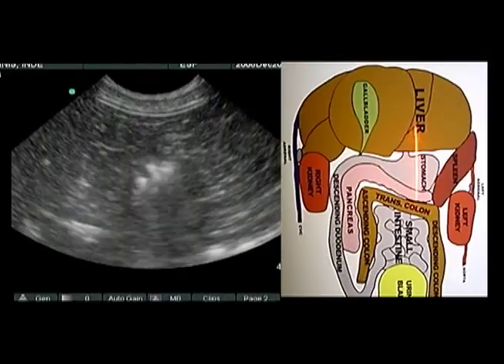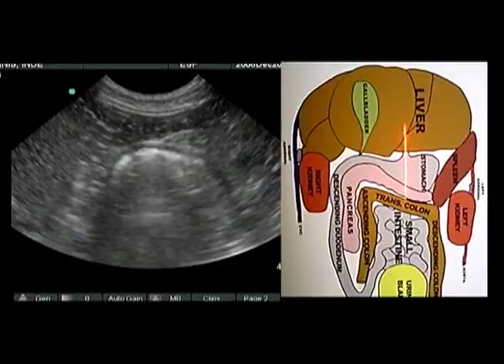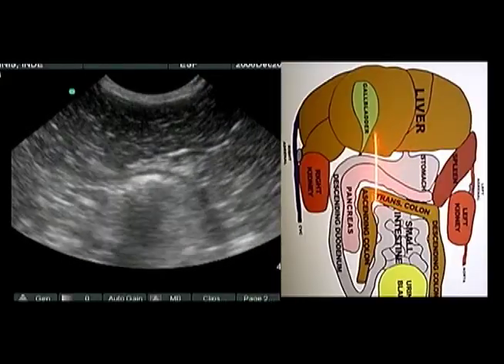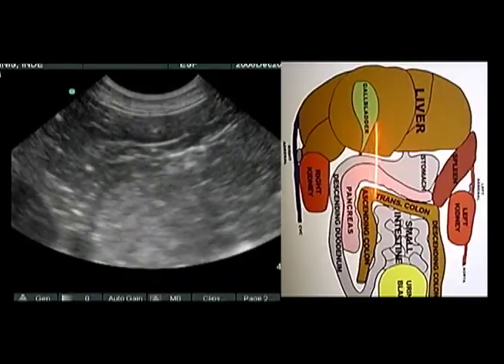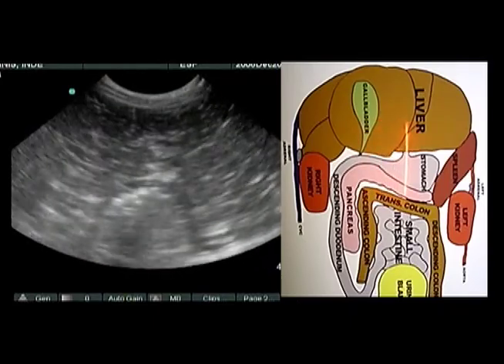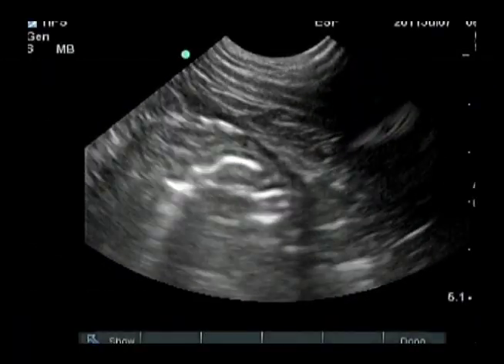The only thing you see on the ultrasound screen is what lies inside of the ultrasound beam. In this case, part of the stomach. To see more of the stomach, you must use the transducer to move the ultrasound beam. Your movements of the ultrasound beam must be slow, small, fine, rhythmic movements.